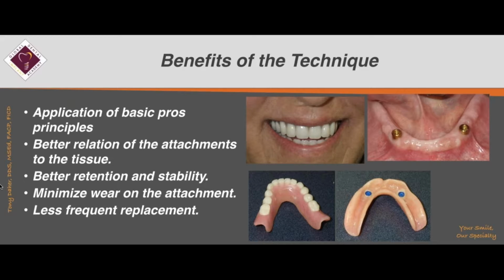Another thing I forgot to mention to you when I showed you that video of that autocentric type of occlusion. Somebody asked me and said, well, if you get this nice retention or stability of that denture, why do we need implants?